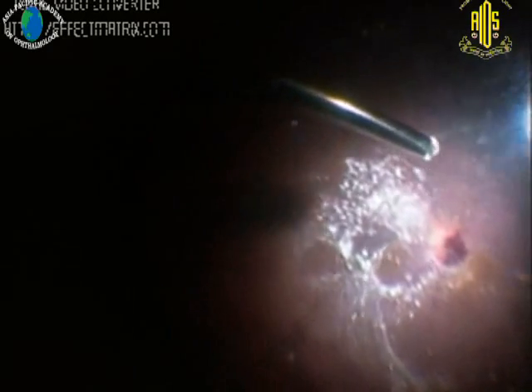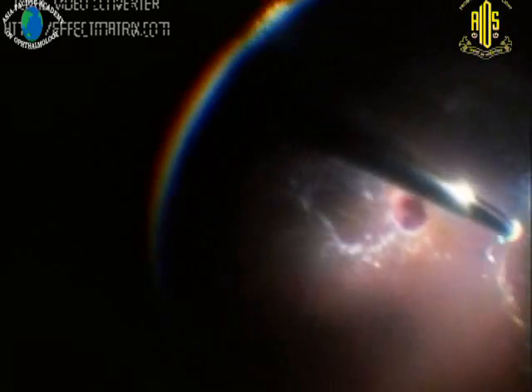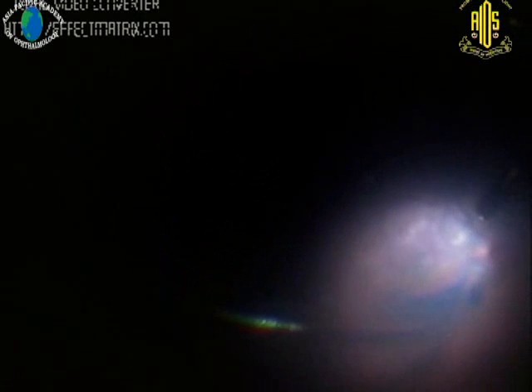So this is the ERM being removed, followed by ILM removal, which I will skip. Now the important thing to stress here is, this is the ocular part of the management, but the systemic part is equally important. These are the patients who are at the risk of fatal cerebral aneurysms, and therefore, especially when retinal lesions are present, we must do an MRI of this patient even if they are systemically asymptomatic.